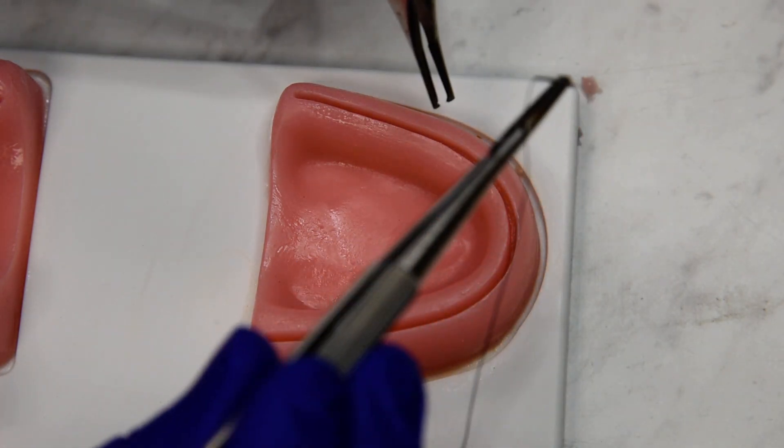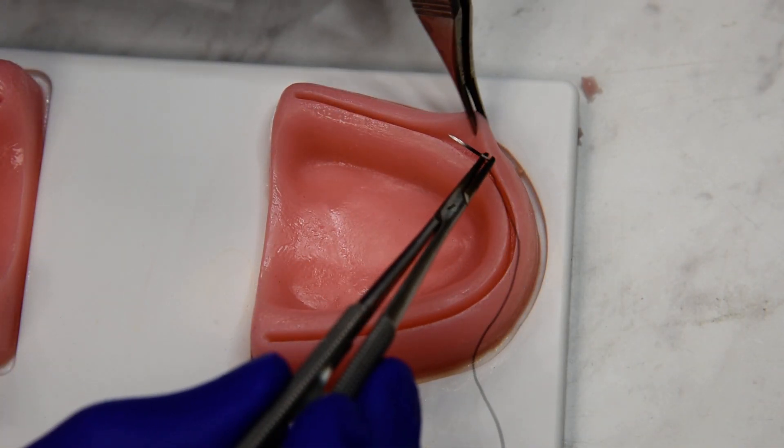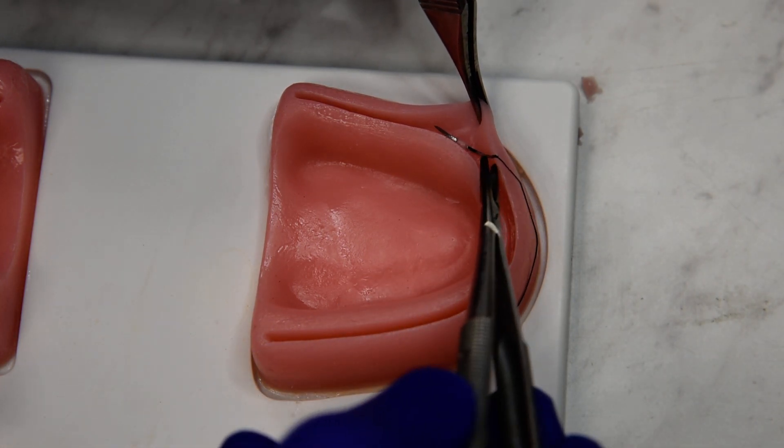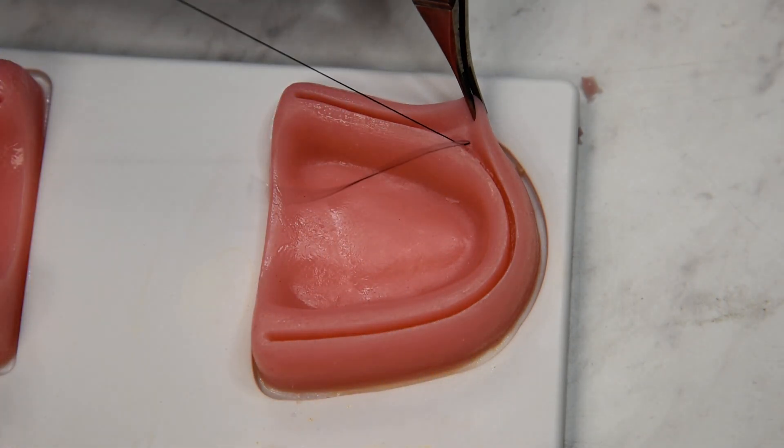So the first bite, often with Castro Viejos, is going to be parallel to the bone. So we're just biting periosteum, turning our wrists going back out, and then we'll get rid of some of the slack.